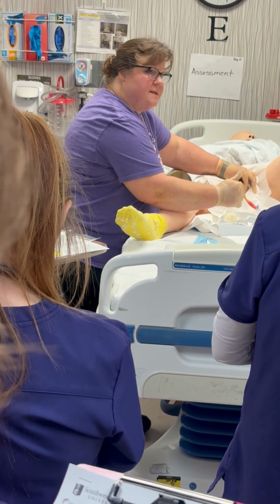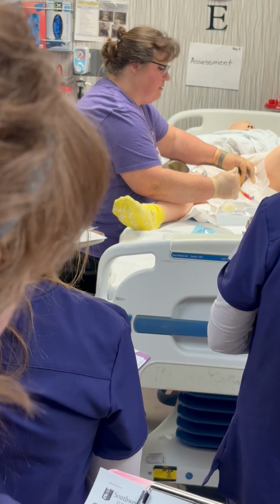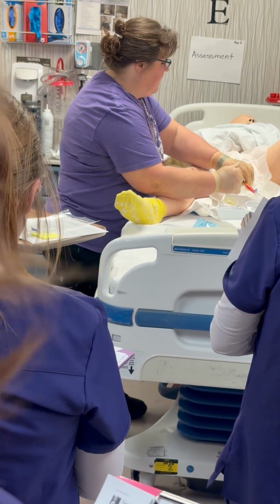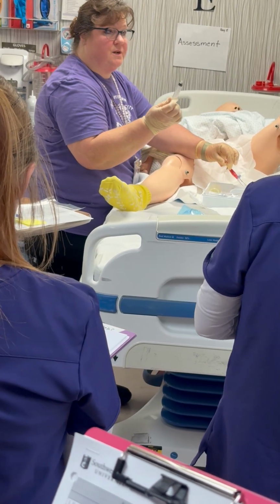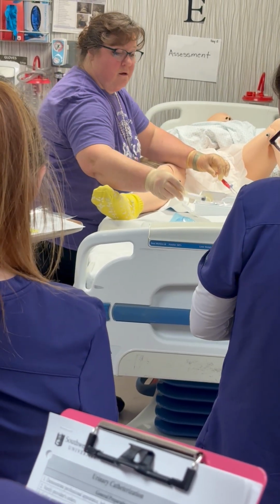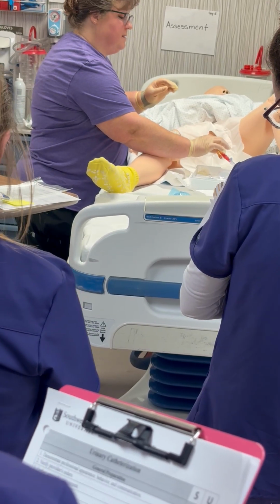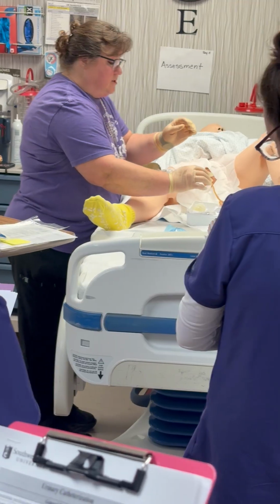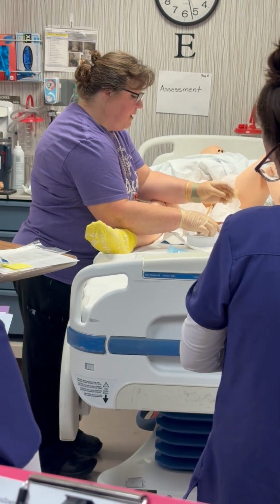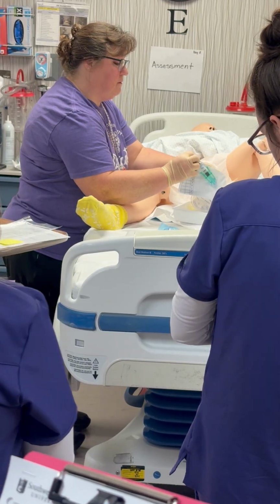At this point, right here, I am no longer sterile. I don't have to be sterile. Take this hand off, and I'm gonna pull back a little bit, because I have to have this hand to take this syringe off, okay? And I'm pulling back just so I know that the balloon is in the bladder, okay? So now, I just gotta finish up and put this on.